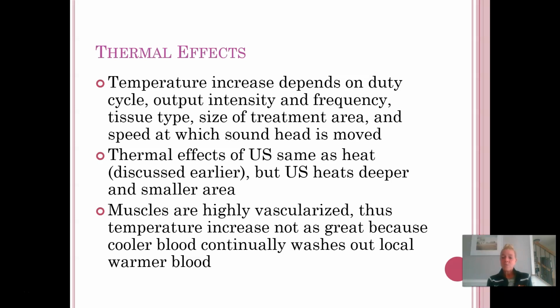moved. If you move the ultrasound head really quickly, really rapidly, you're not going to give heat time to build up. If you move it too slowly, you're going to give heat a lot of time to build up, and you could potentially make the patient uncomfortable. So again, we want to try to find a moderate speed with our ultrasound head.